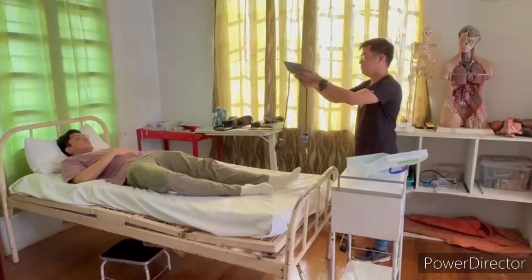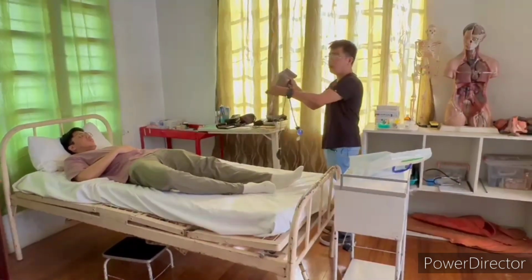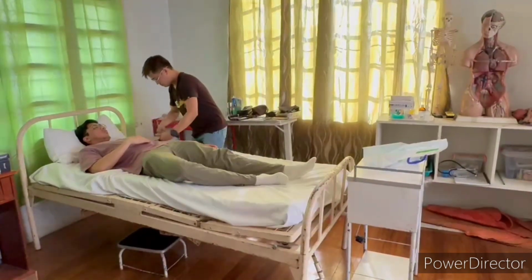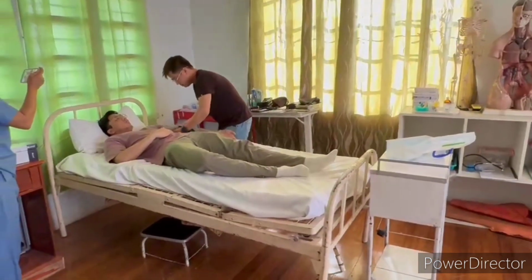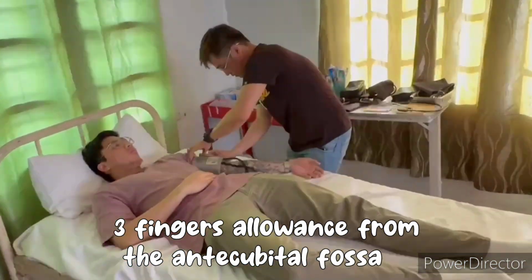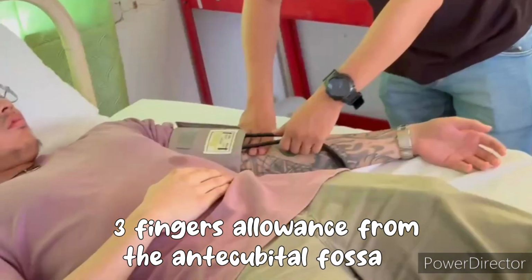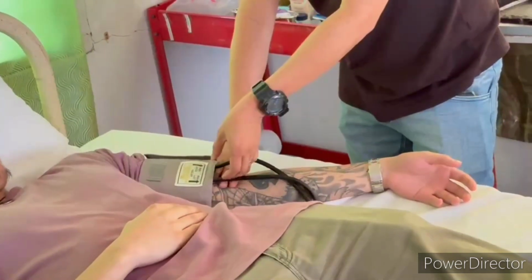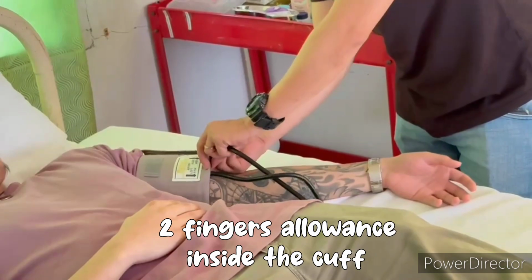place the cuff. Get the sphygmomanometer, and then we're going to be placing the cuff onto the arm of the patient. In placing the cuff, we have to make sure that there are 3 fingers allowance from the antecubital fossa. Okay? And you also have to make sure that the cuff is not too tight and not too loose by making sure that there are 2 fingers allowance inside the cuff.